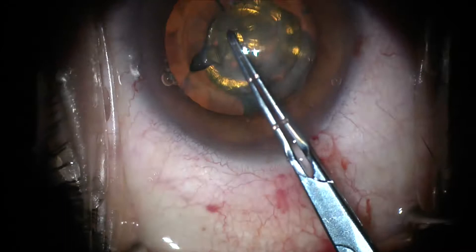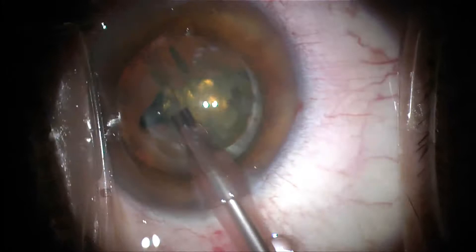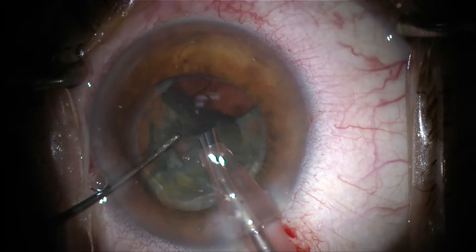We're now using an ultrasound device, a phacoemulsifier, to remove a central area of the lens. You can see that the lens has already been broken up into pieces, and these pieces can be removed with the phacoemulsification piece. The other instrument just basically guides those pieces into the mouth of the ultrasound.